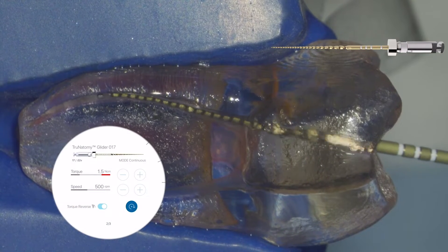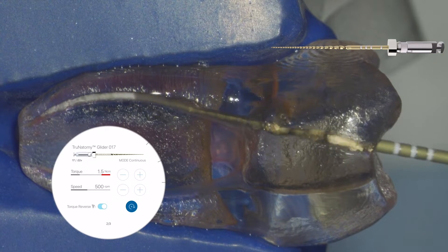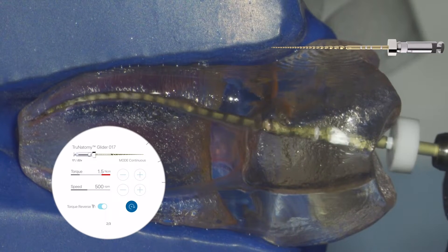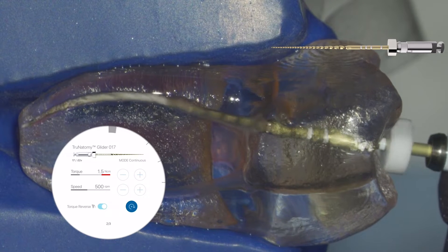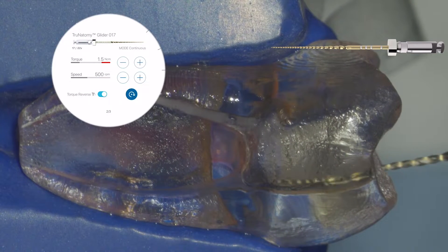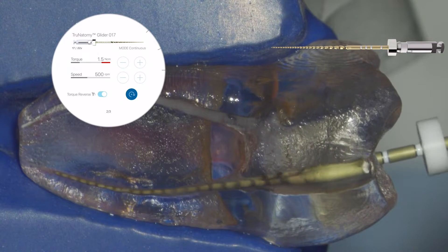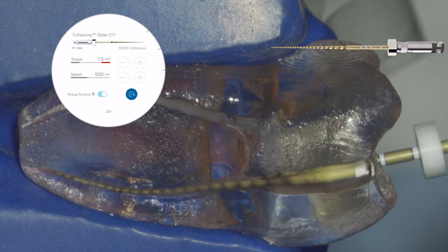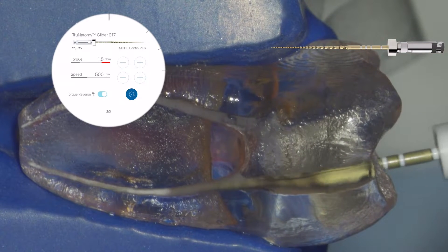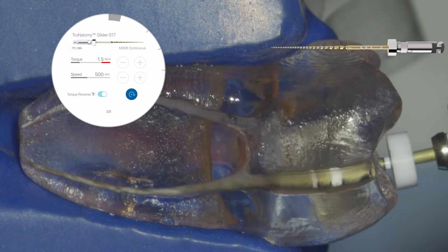Now that we have our coronal modification, working length, and confirmed patency, we want to confirm our glide path. We want a mechanical glide path using something flexible — the True Anatomy glide path instrument — which confirms a centered glide path for your shaping instrument. This may take approximately two or three sets, or three to four sets in difficult or curved cases.